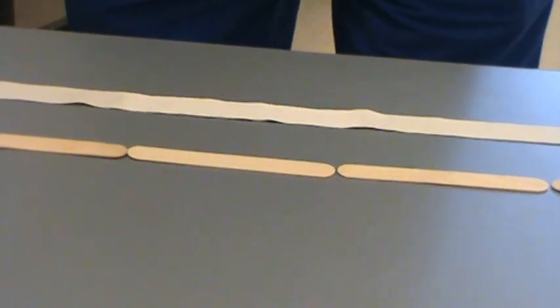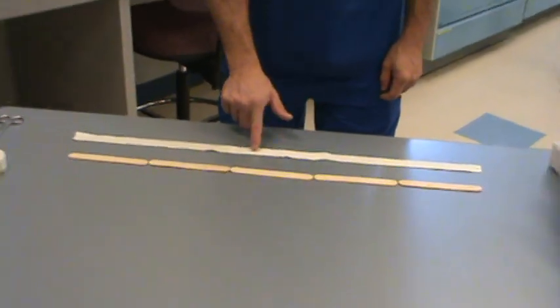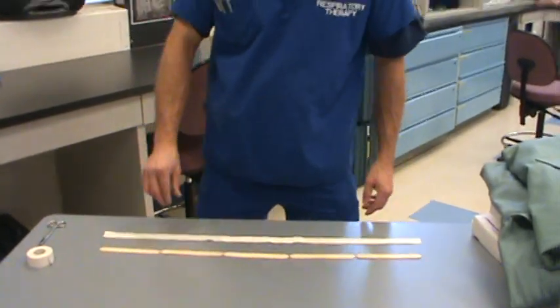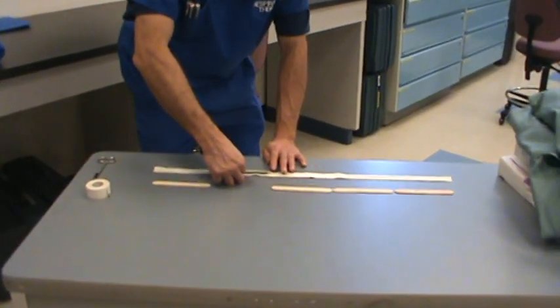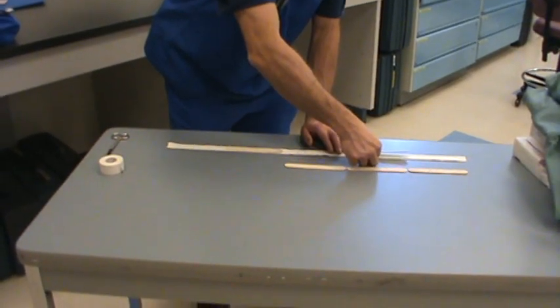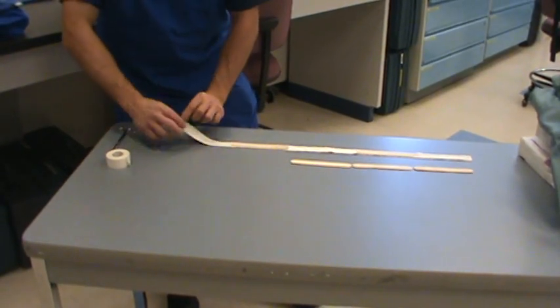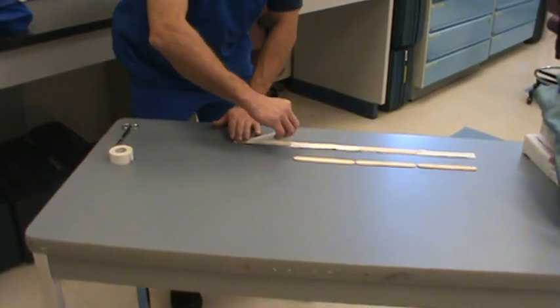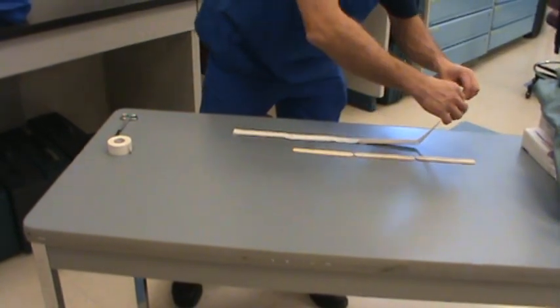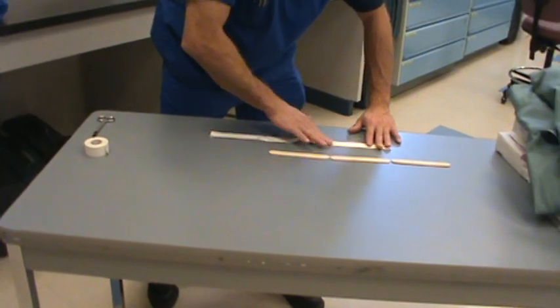So I've got my lengths, I've got my centered double-sided piece of tape. This part goes on the patient's neck, so that's why it has to be double-sided. All I'm going to do now is take a tongue depressor like so, place it right over here on my tape, grab another one, place it on the opposite side here on my tape, and now I'm going to fold the tape back on itself onto the tongue depressor, and it can stay in this fashion until it's ready to be used. So it's this tape here that I'm going to use during my intubation.